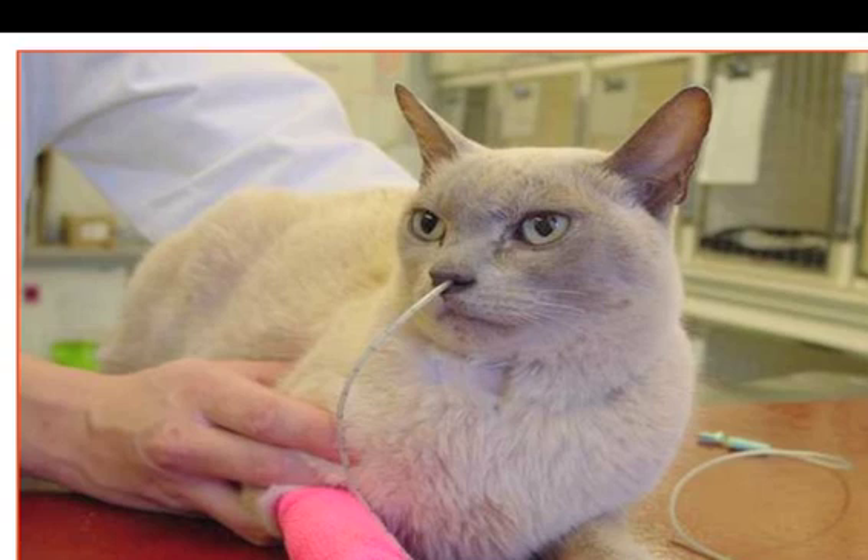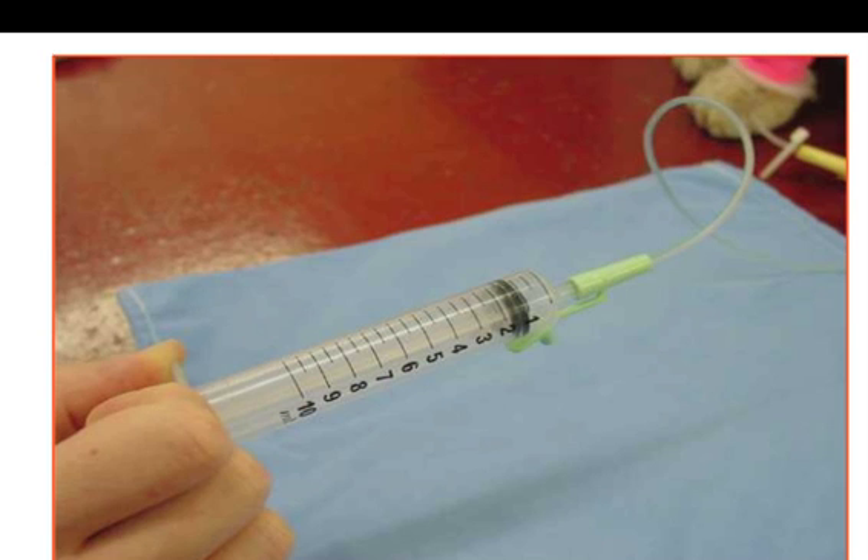And just to prove the tolerance level — this little Burmese cat is a pancreatitis case from Bristol. Burmese are pretty sedate, but I wouldn't say this cat was necessarily the most sedate. We're not scruffing this cat; we're not going in really aggressively. You can see he's okay. Once he got past the nose, we're all right — it's just sitting there quite happily.